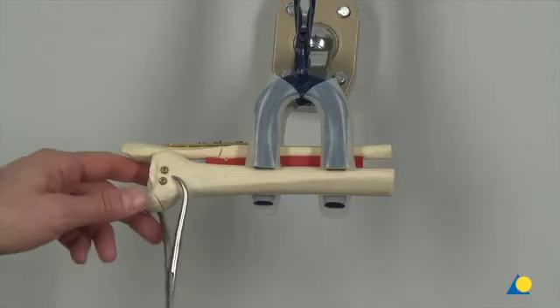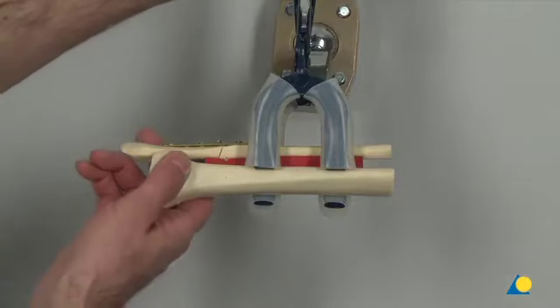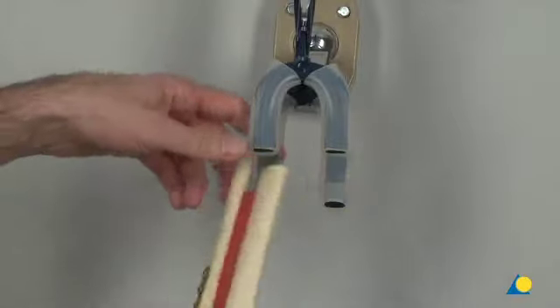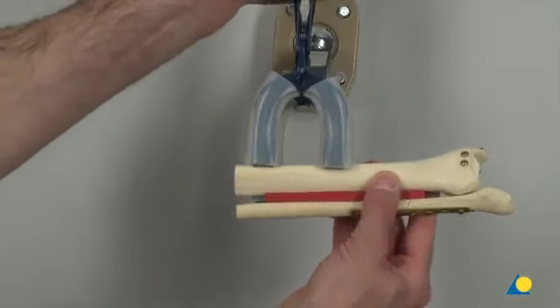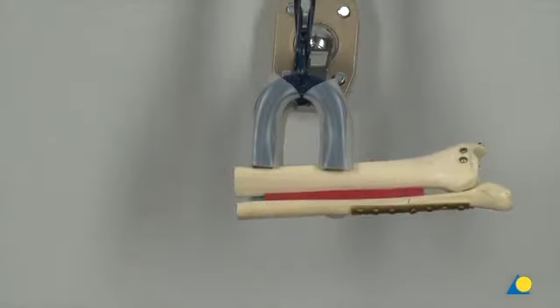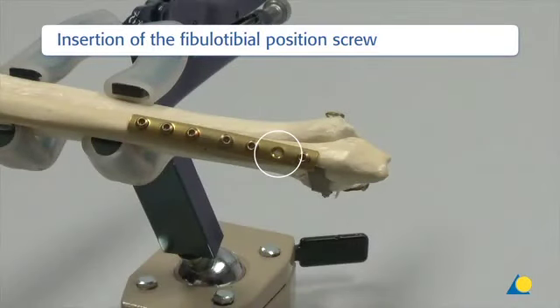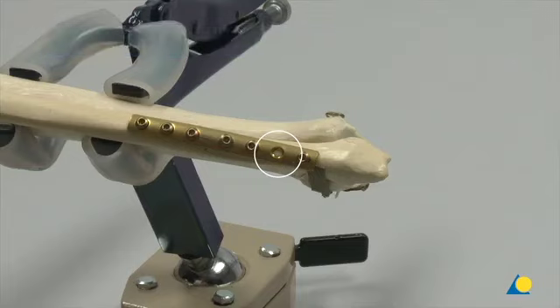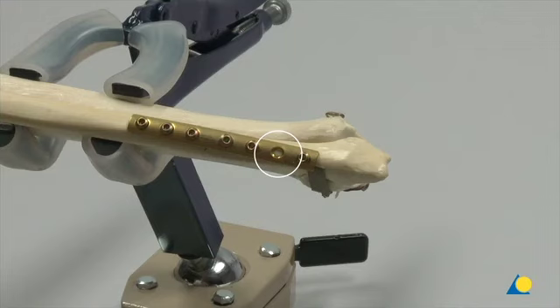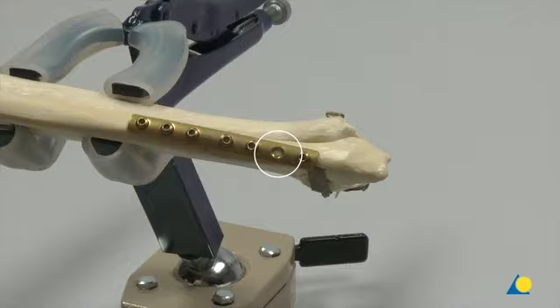The reduction forceps is removed. To facilitate the insertion of the position screw, the bone model is rotated 180 degrees and returned to its original position. In the clinical situation, the ankle is dorsiflexed for the insertion of the positioning screw. This ensures that the upper ankle joint is at its widest position.